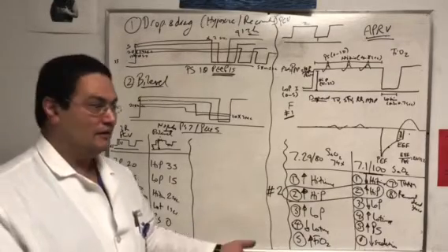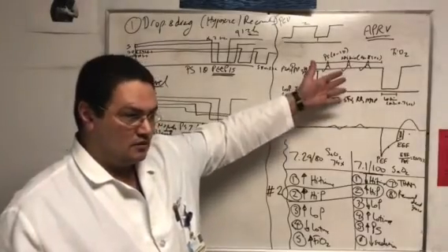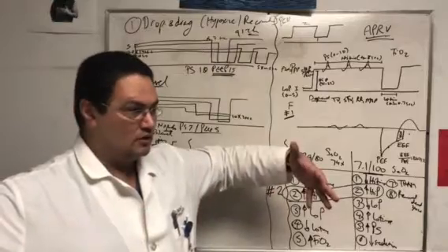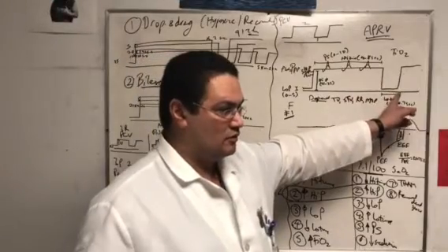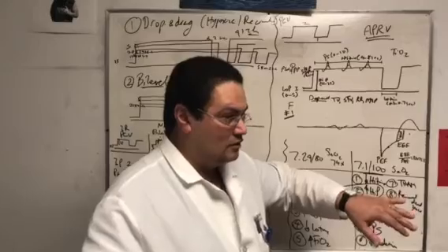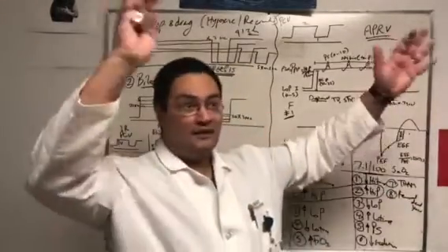Yes, the venous return. So basically, if you put somebody on this mode that has normal lungs, all of the pressure inside the alveoli is transmitted directly into the vessels. So no venous return for 6 seconds. And then you allow her to have a venous return for 0.5 seconds, so a little bit of blood comes out, and then you go back up again. And so then she drops the blood pressure, and everybody says, septic shock!